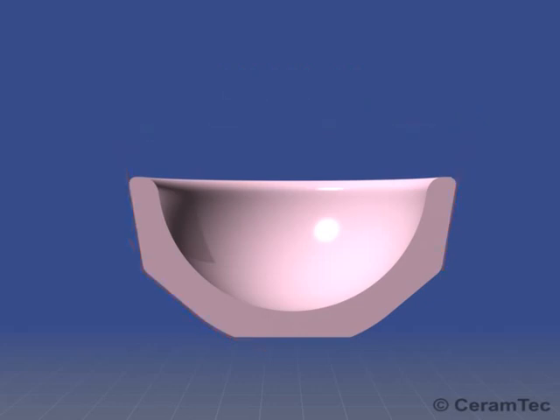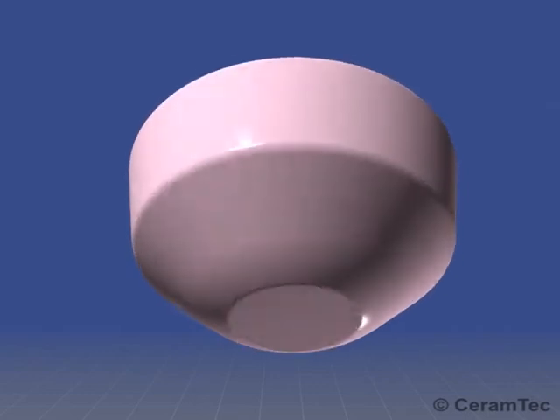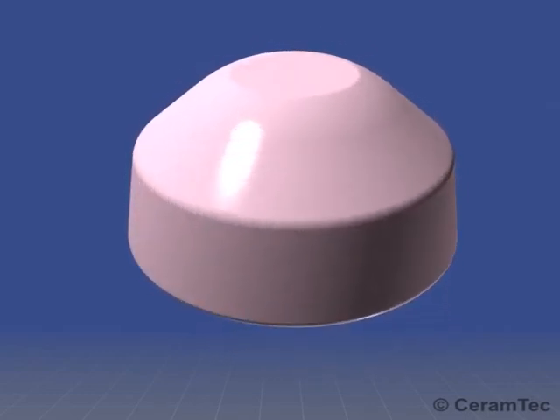Highly sophisticated manufacturing technologies make it possible to produce inserts with low wall thickness.